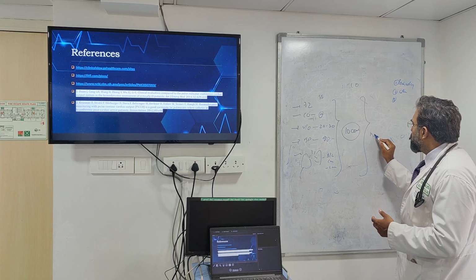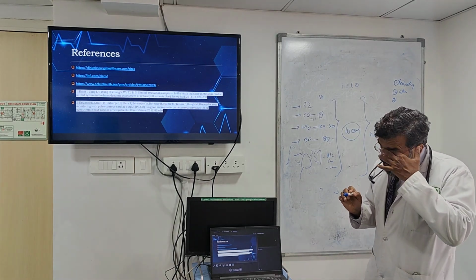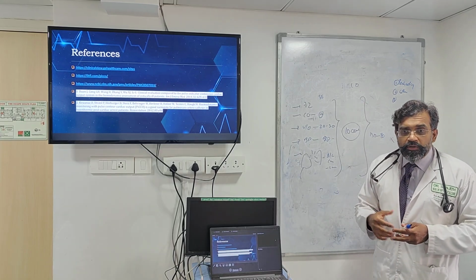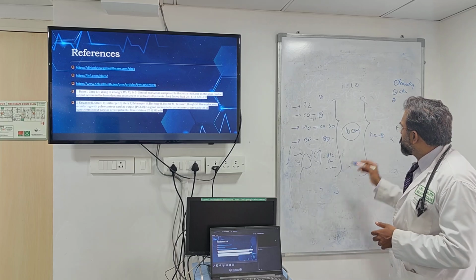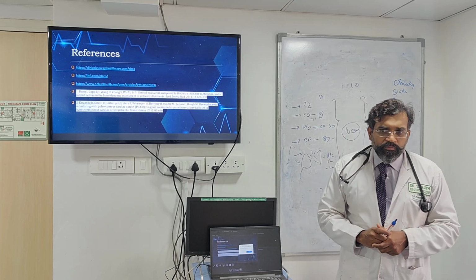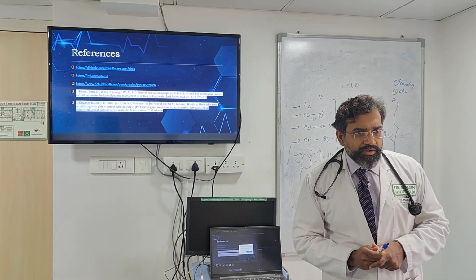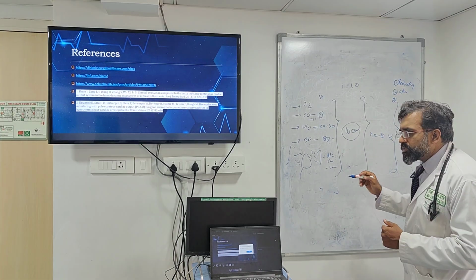No improvement of BP. BP remains at 80. Now the question comes, what do I do further? It's a vasopressor. I started vasopressors. But what is the guarantee that your fluid has been adequate before you start your vasopressors? What is the guarantee?